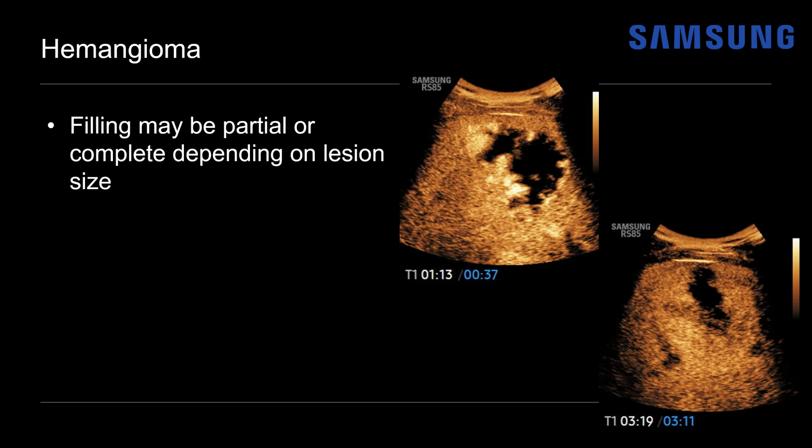That's okay as long as the overall enhancement pattern is concordant with hemangioma — filling can be partial or complete depending on lesion size. This is also an example of a hemangioma that becomes relatively iso-enhancing on the delayed equilibrium phase, as the three-minute image shows. They're not always hyper-enhancing relative to the surrounding parenchyma on the delayed series.